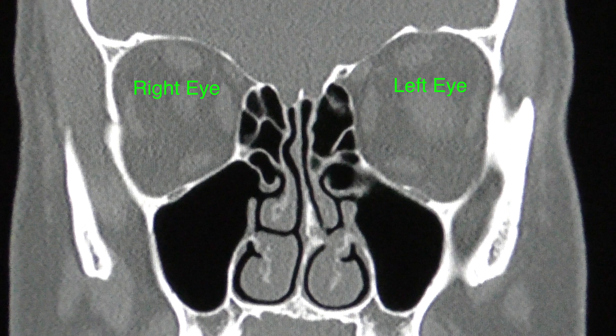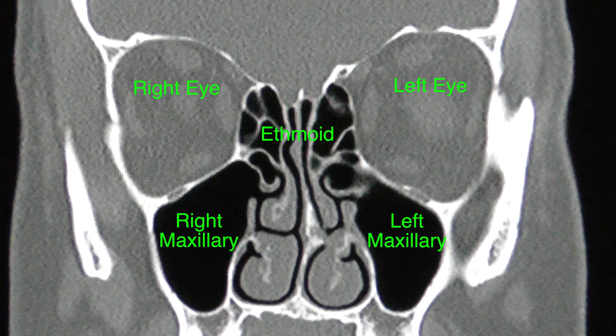The main slice that provides the most information in the coronal plane with respect to the sinuses is where one can see both eyeballs, brain, ethmoid sinuses, maxillary sinuses, and the tongue as shown here.